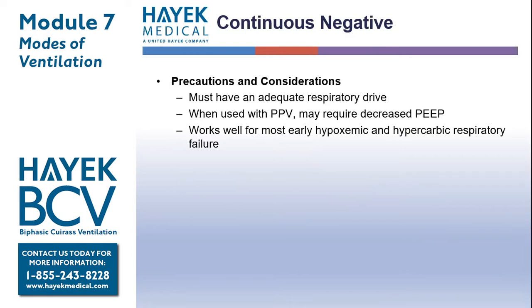Precautions and considerations for continuous negative. Patients must have an adequate respiratory drive. There is no backup rate in continuous negative, so patients must have a competent and intact respiratory drive. There is a potential for monitoring for apnea, but recommendation is to have an intact respiratory drive.